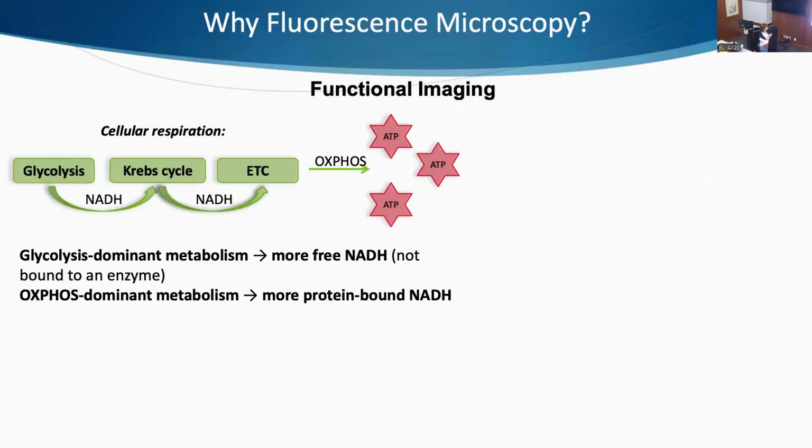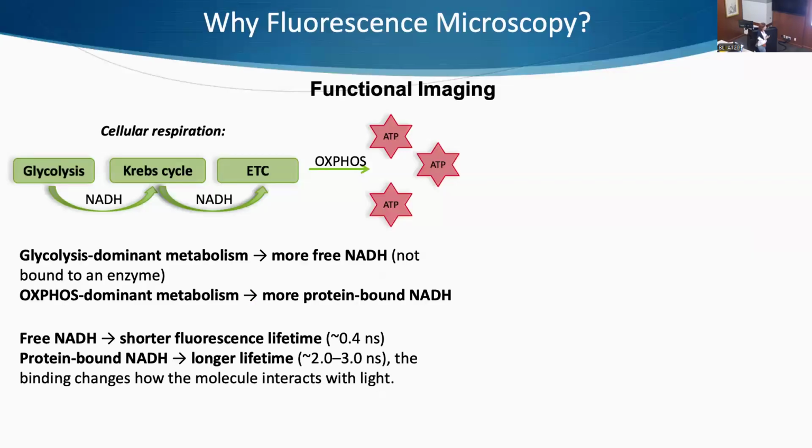I'm bringing up the NADH significance in the process. We are focused on the NADH because we can actually measure the NADH contribution, and through that monitor metabolic changes in cells. We can measure NADH contribution through its fluorescence lifetime.